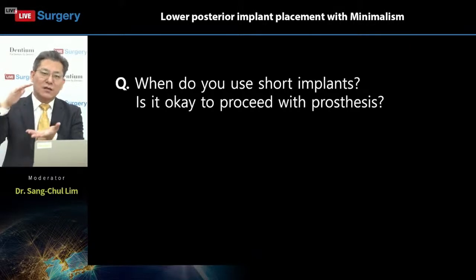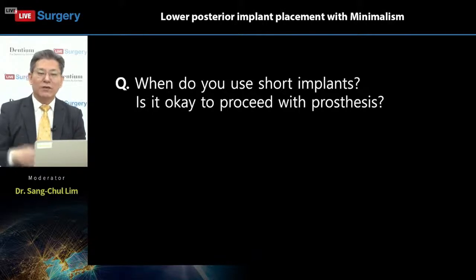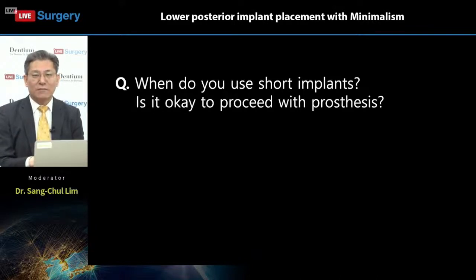It means one portion is the implant inserted into the alveolar bone, and from that point, a superstructure up to 2 times bigger, including the platform area, is accepted. So a 1 to 2 ratio is acceptable. This is the concept you have to keep in mind when you use a short implant, right?